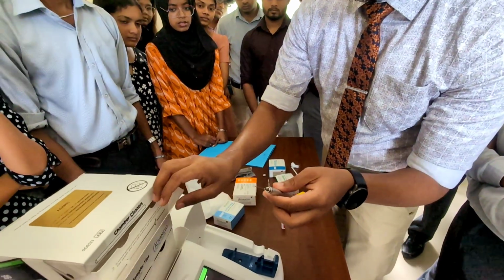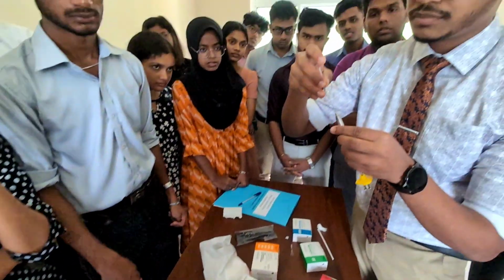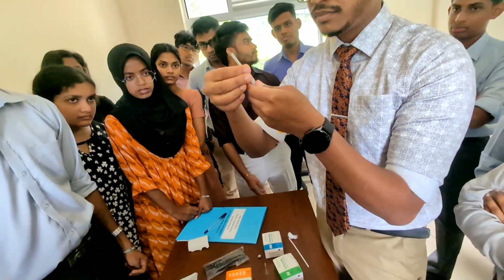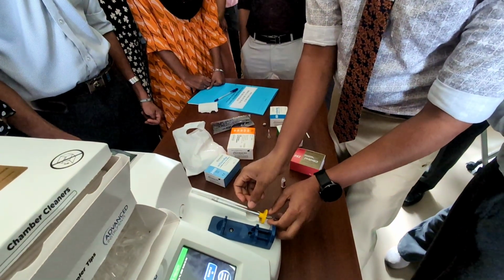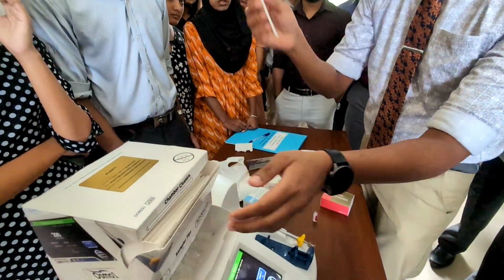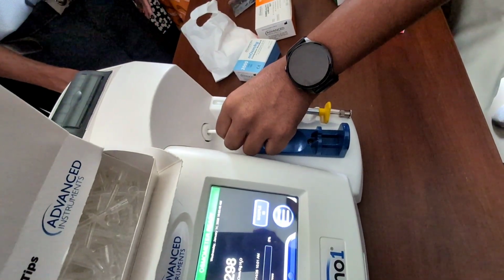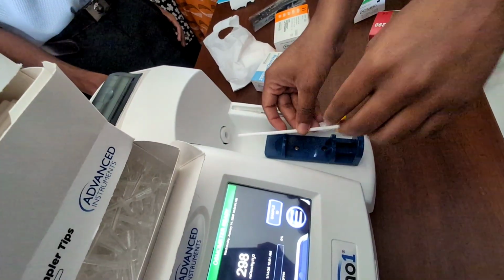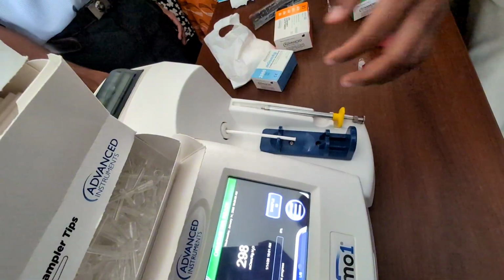Then we get another sample tip, insert it like this and keep it over here. Then we also have to clean the chamber. So these are the chamber cleaners. We get a new one and clean it like this. We have to rotate it once or twice and keep the other side in like so. This is how it's supposed to be after every use.